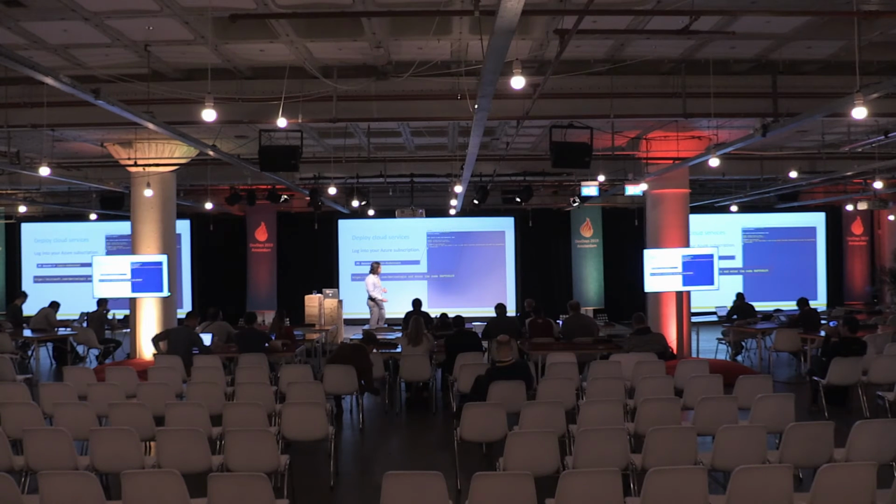When you type this in, you're going to see this message. It's going to prompt you to go to this Microsoft.com/device login and then type the code in. The easiest way to get this done is you just select the code, you copy it, and then you should be able to click on this link, and it'll open up a separate browser tab. You can log in, and then you can come back to this.